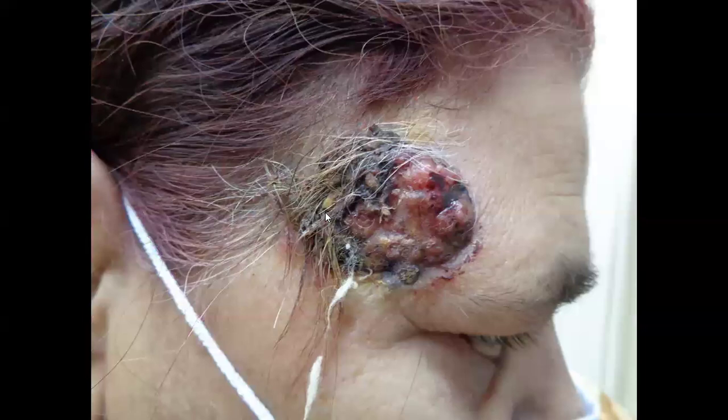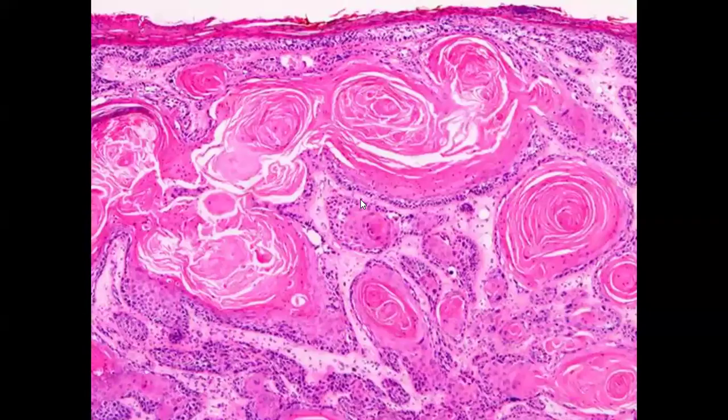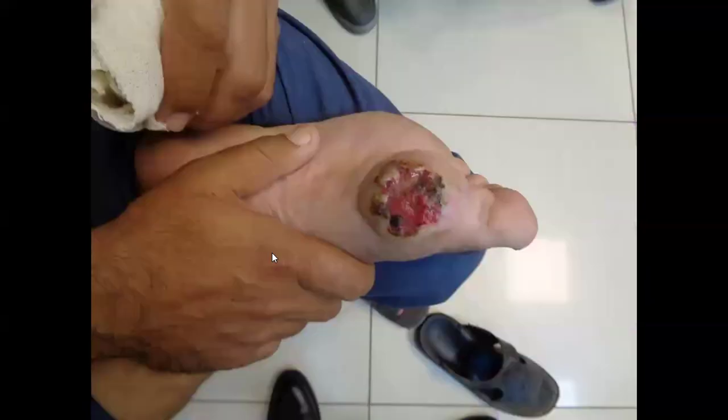This is not a good lesion, a quite angry-looking nodular lesion with irregular pigmentation. It could be melanoma, it could be squamous cell carcinoma. You must take a biopsy. In biopsy, we find multiple nests of atypical squamoid cells with keratin horn cysts within the nests. So this presence of keratin horn cysts shows that keratinization is happening, and this is not a very atypical lesion. So this is a well-formed, well-differentiated squamous cell carcinoma.